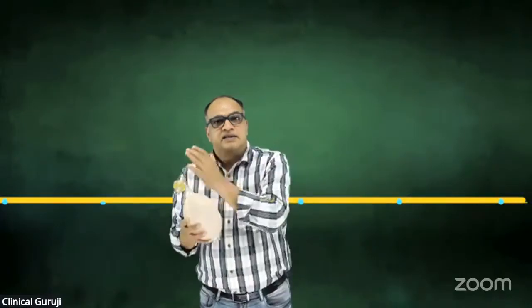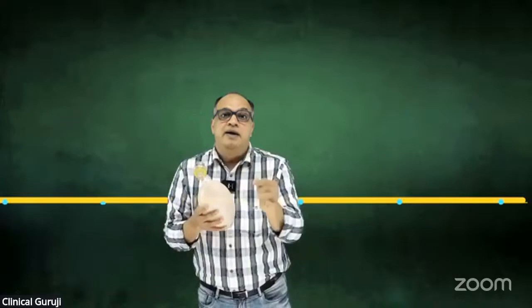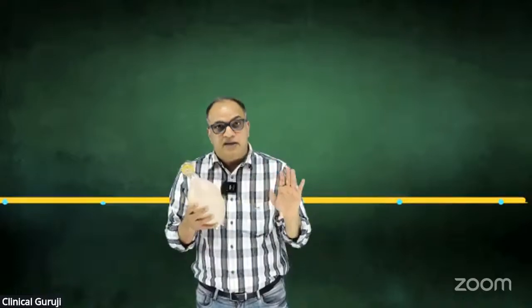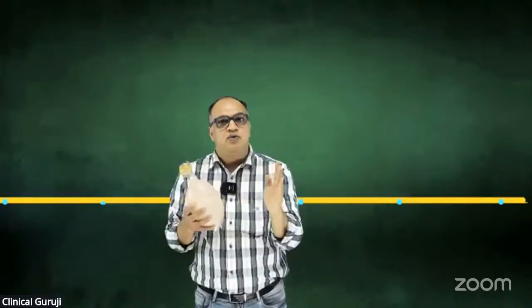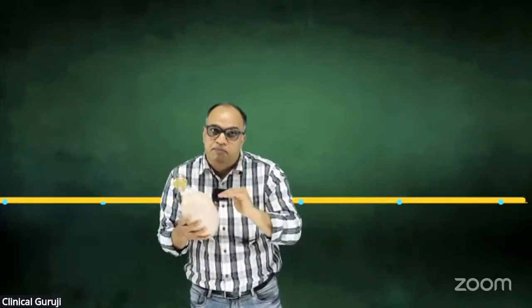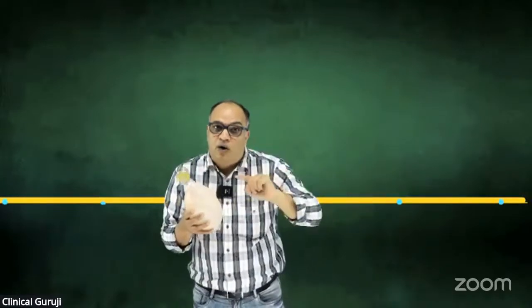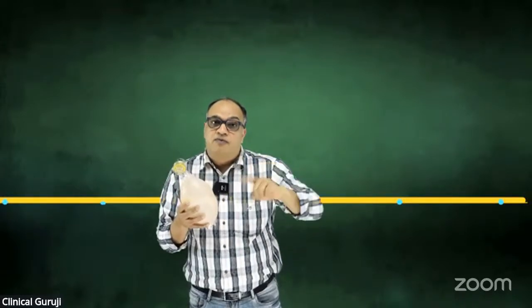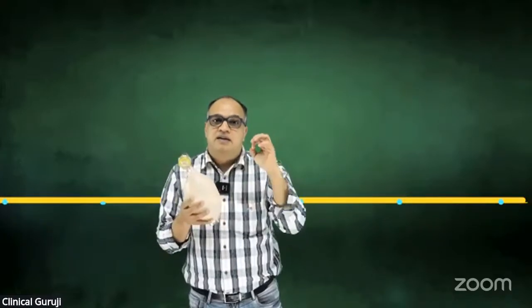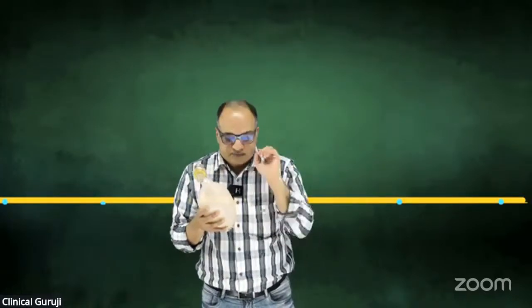So the mandatory breath tidal volume is fixed at 500. The spontaneous breath tidal volume will depend on how much effort the patient generated. So the patient is getting a minimum of 500 into 12, plus all his spontaneous breaths are supported with pressure support. Unlike ACMV, when all the triggered breaths were supported with a fixed tidal volume of 500, in SIMV PS the spontaneous breaths are given 15 pressure support. Are we together here? Okay.